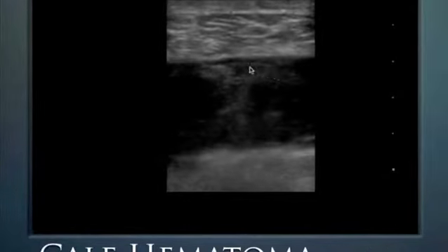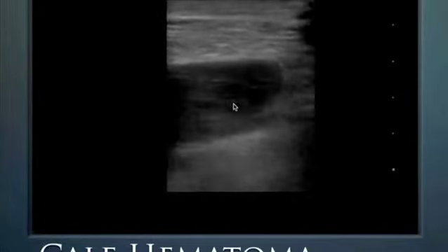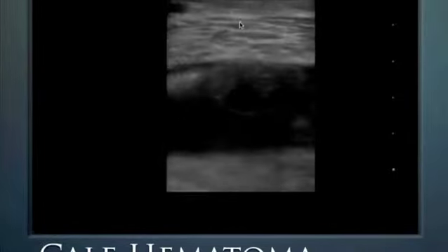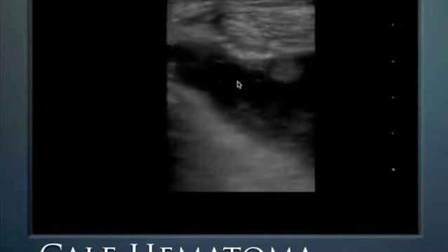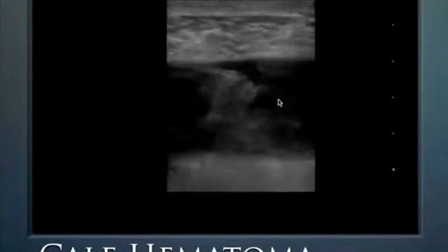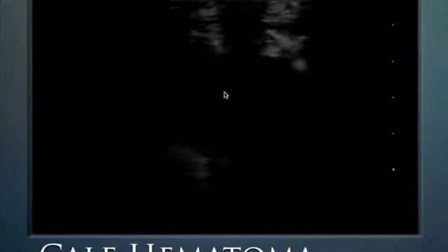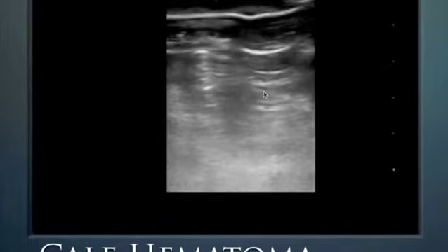And finally, some things look like abscess, but they're just hematomas. And that's what this looks like here. This is in the patient's calf. This is muscle we see up here, and this very hypoechoic area with some anechoic areas to it, this is what a calf hematoma looks like. It's all spreading out back here. And on the patient's skin, too, there's prominent ecchymoses seen as well.